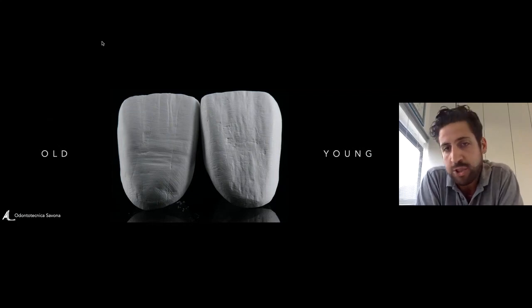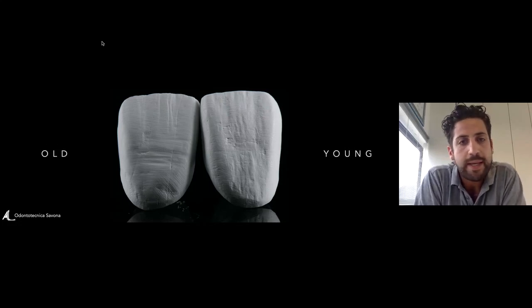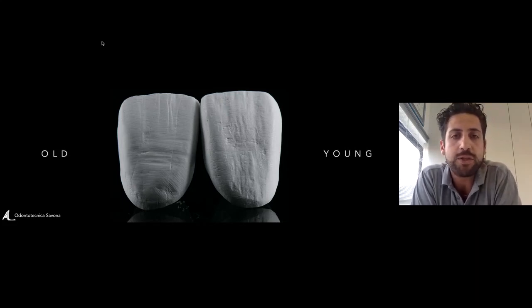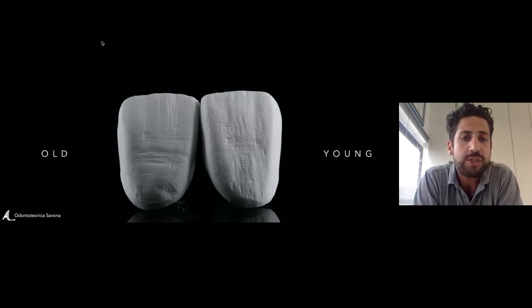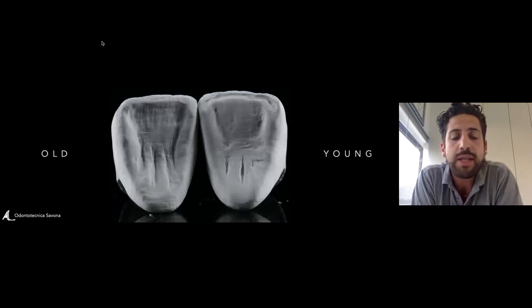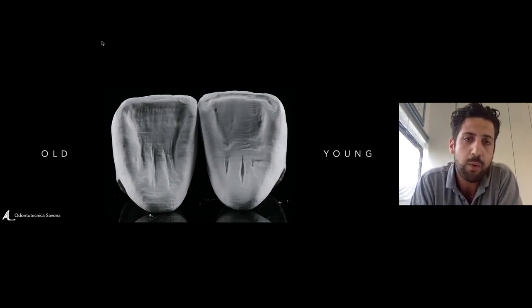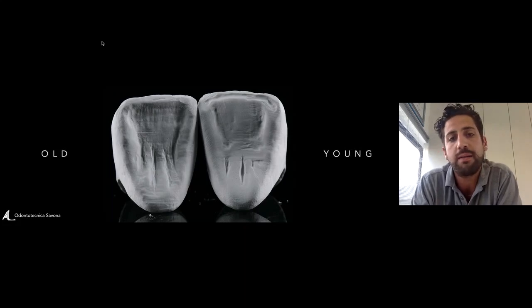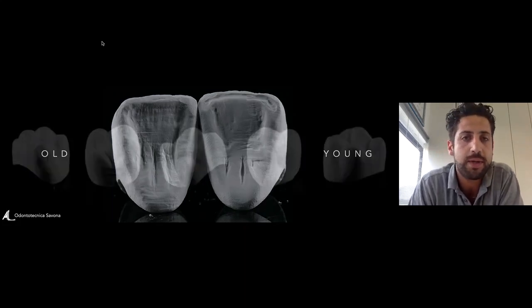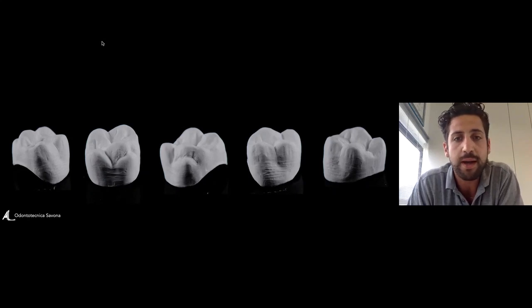In this case, I made this showcase, these two single crowns. One is an older crown, and this is a younger crown. I made this difference because for sure the texture and the surface are different. Also, the characterization, the coloration of this kind of zirconia will be different. Also, on the palatal side, we can see the different construction of the surface. In the younger one, we still have a really nice shape, and in the older one, we made, for example, this incisal abrasion on top. That's also a molar. We will see also the difference with the posterior tooth.